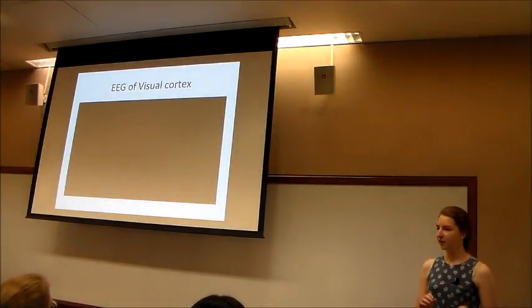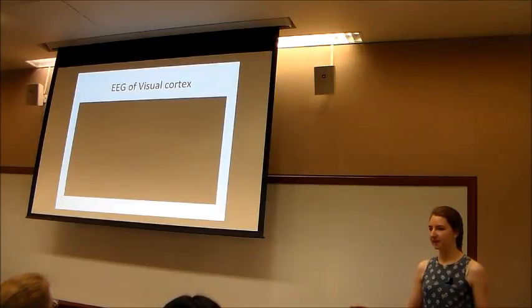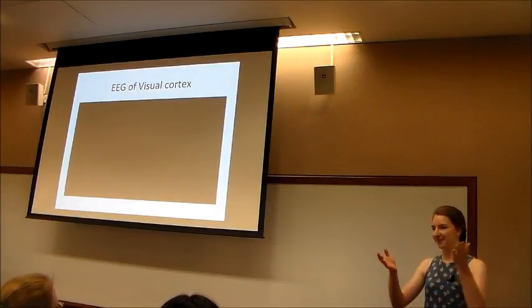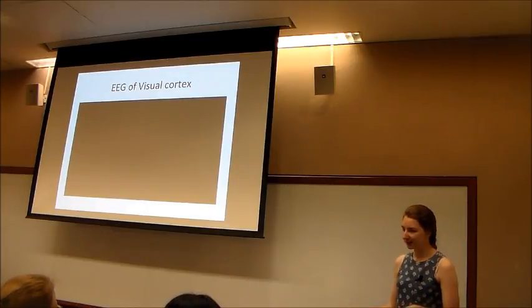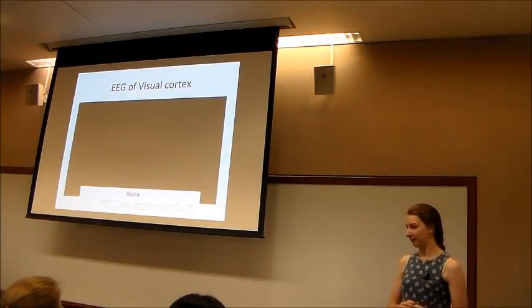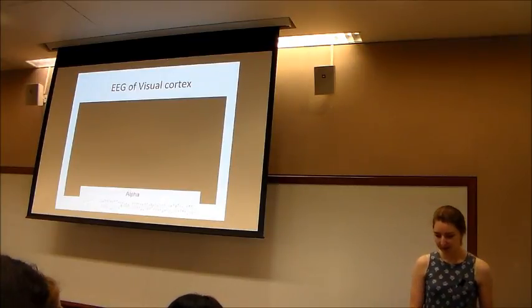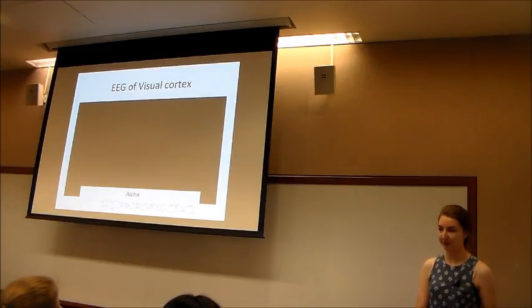On the other hand, if your eyes are closed, you're still awake, but all your neurons are seeing the same thing. Now the activity of the neurons is synchronous. If the activity is more synchronous, the wave will be slower. So if you measured this, you would see not a beta wave, but a slower alpha wave. Right? So we will quickly try this on a person and see if that's what we see.